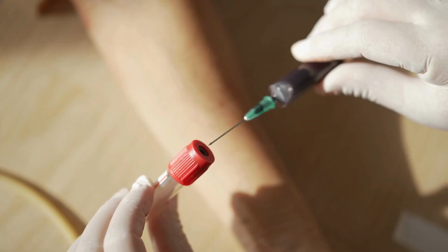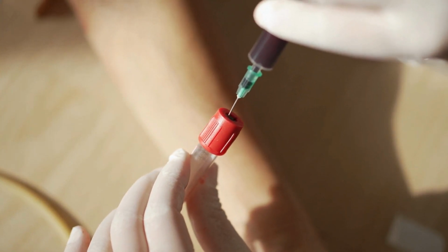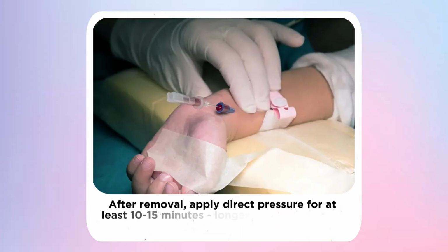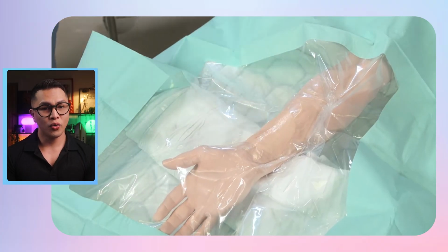When it's time to remove an arterial line, this isn't just pulling out a catheter. You need to check your patient's coagulation status first. If they have abnormal clotting, discuss with the physician before removal. After removal, apply direct pressure for at least 10 to 15 minutes, longer if the patient has coagulation issues. I've seen nurses apply pressure for 2 minutes and walk away, only to find a massive hematoma later.